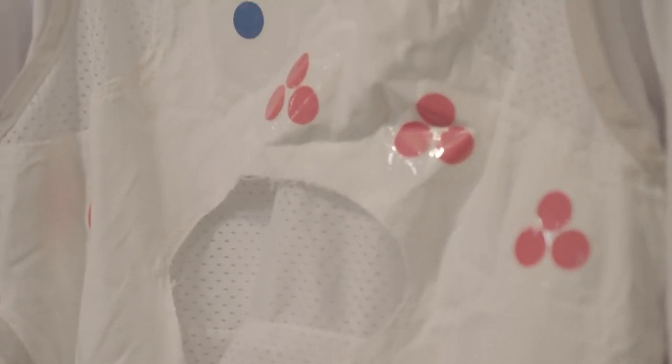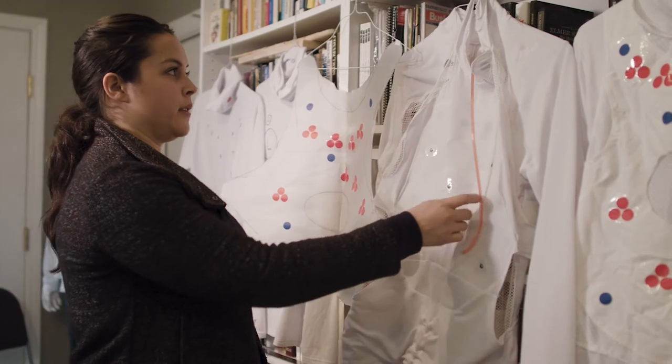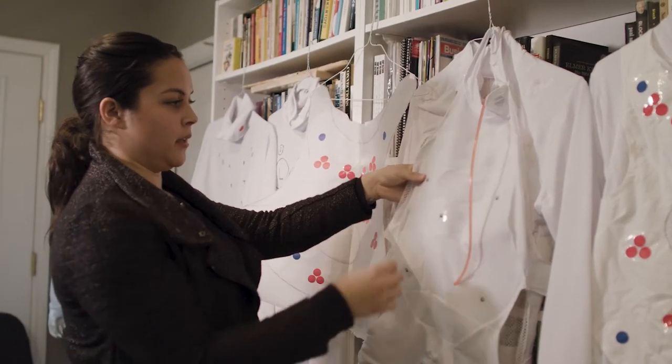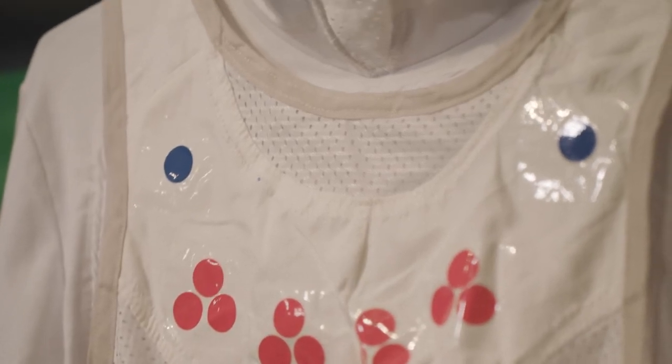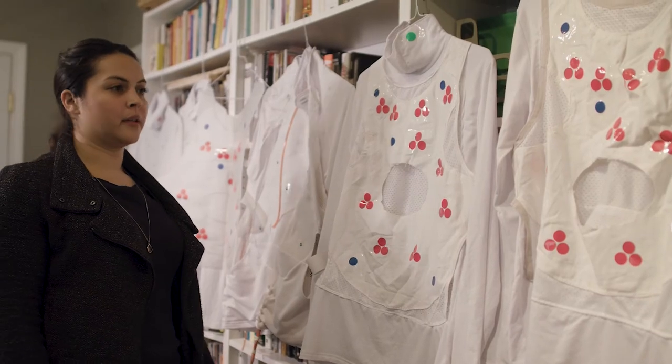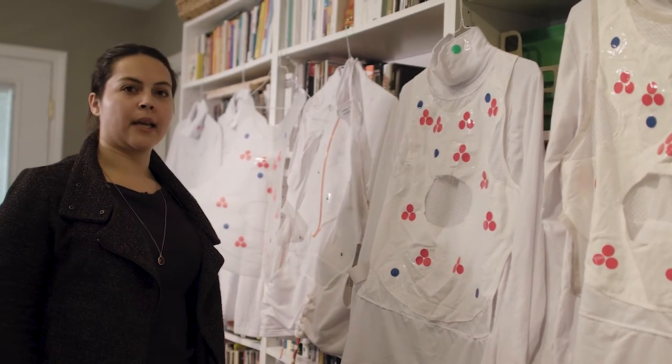We drew shapes around that and determined what kinds of shapes were actually working with the body, and how we could experiment with the different tech coming in and out of the shirt and where the tech needed to go. From there we moved on to final prototypes where we further refined the shapes and placement of the tech.